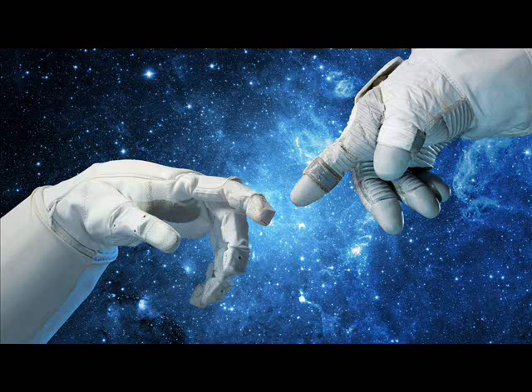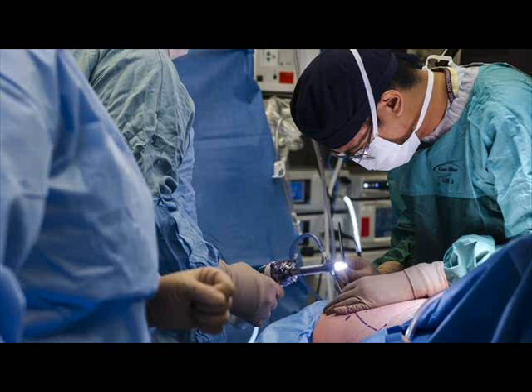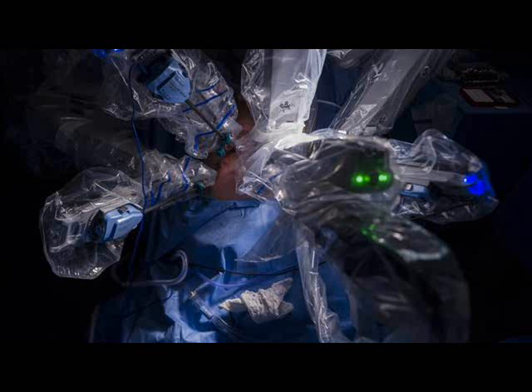Transplant surgery. Transplant surgery has been considered as highly technically demanding and virtually unobtainable by means of conventional laparoscopy. For many years, transplant patients were unable to benefit from the advantages of minimally invasive surgery. The development of robotic technology and its associated high-resolution capabilities, three-dimensional visual system, wrist-type motion and fine instruments, gave opportunity for highly complex procedures to be completed in a minimally invasive fashion. Subsequently, the first fully robotic kidney transplantations were performed in the late 2000s.